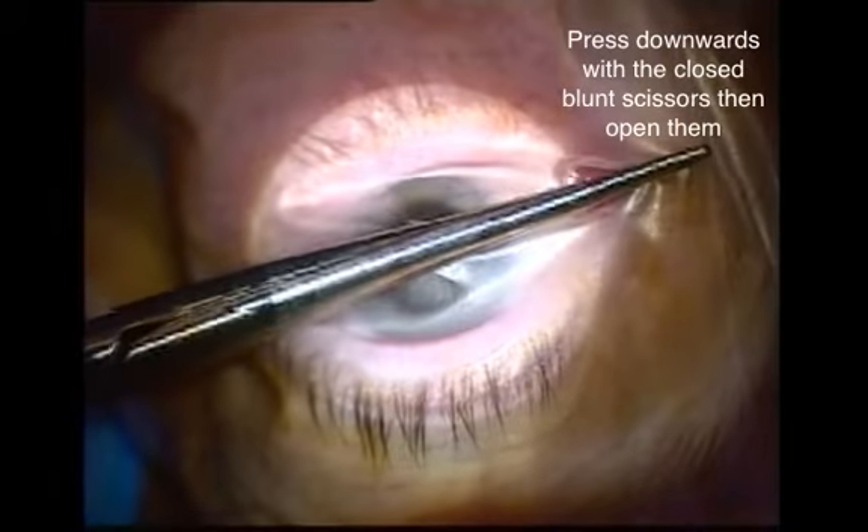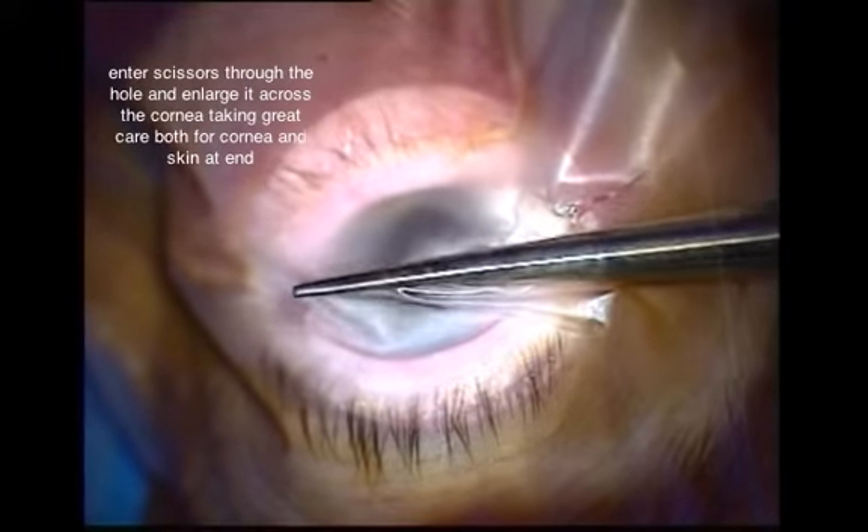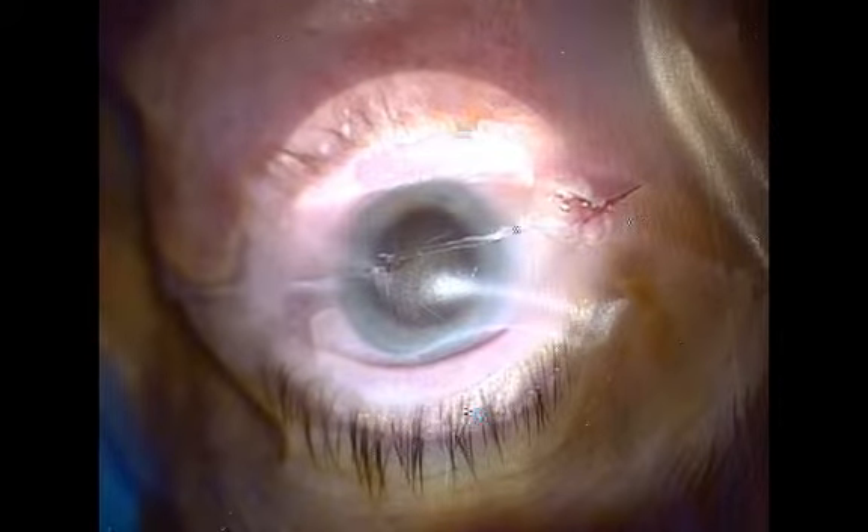Using blunt scissors, taking care not to damage underlying tissues, the closed scissors are pressed onto the drape and then opened, forming a small hole as shown in this video. This hole is then enlarged, always taking care not to damage the underlying cornea and especially the peribulbar skin at the edges.